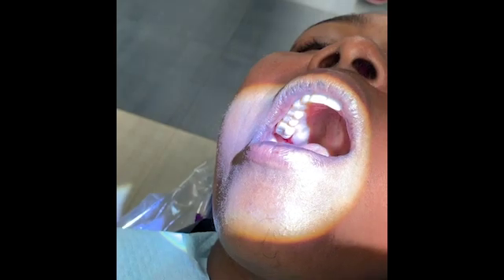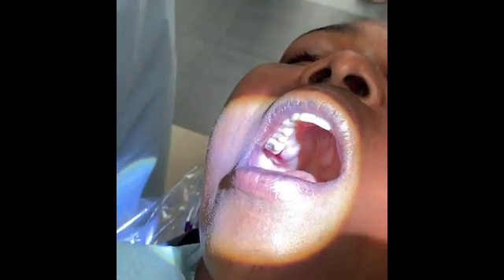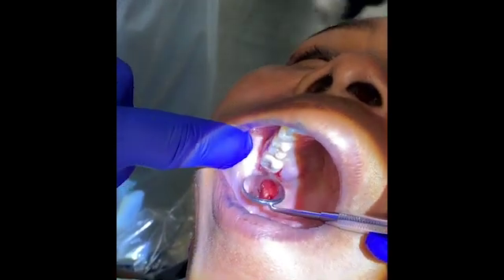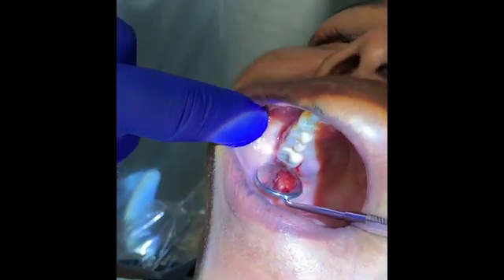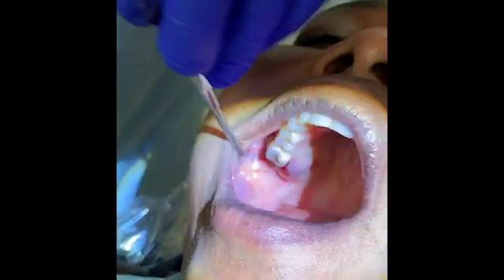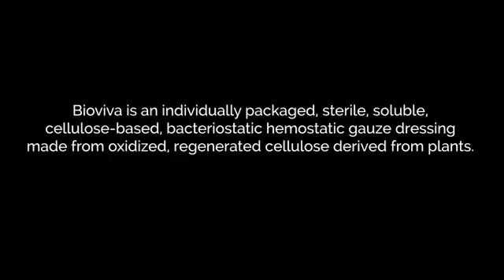I'll just show you in the mirror what it looks like. And here you can see how it stopped the bleeding already. Great. Very good.